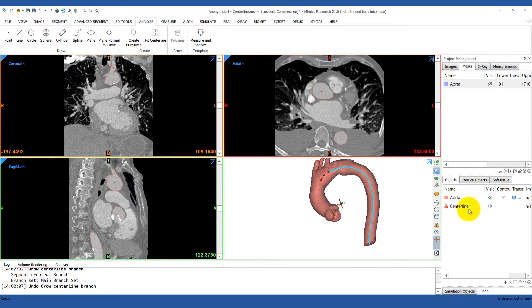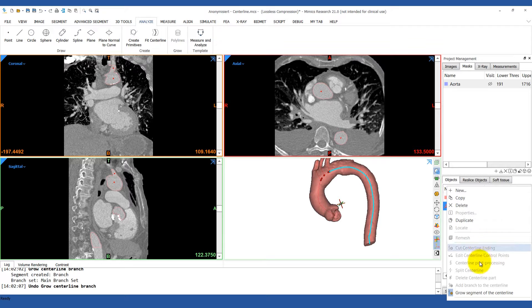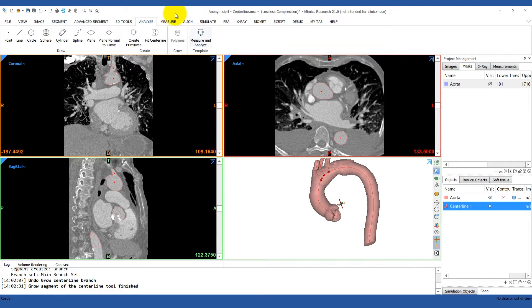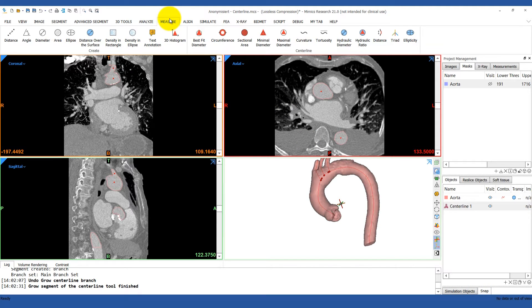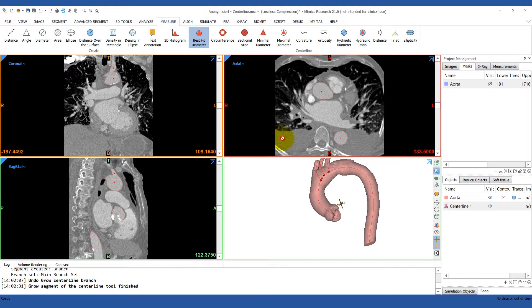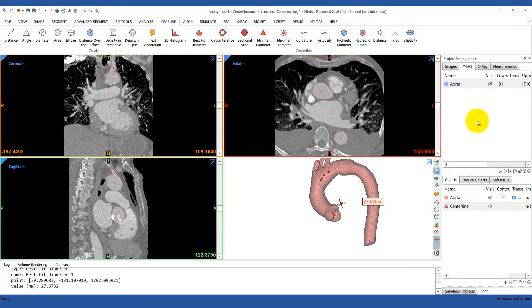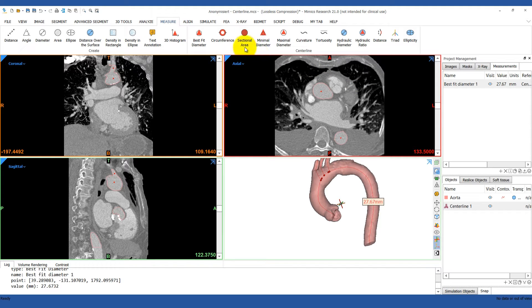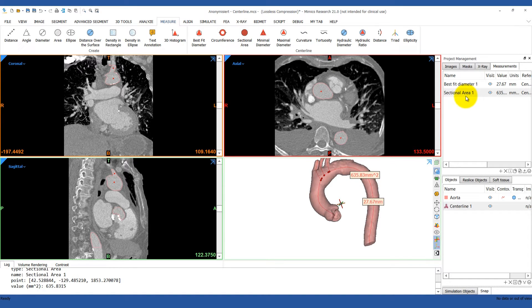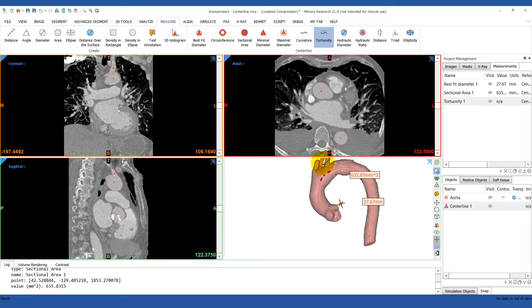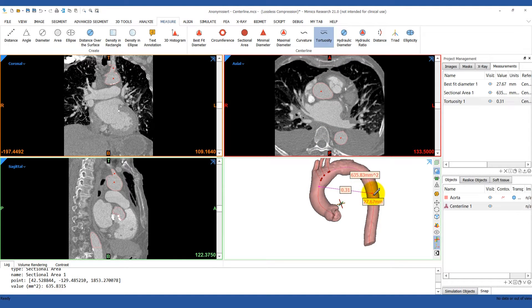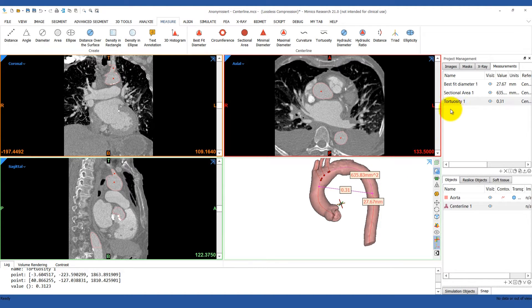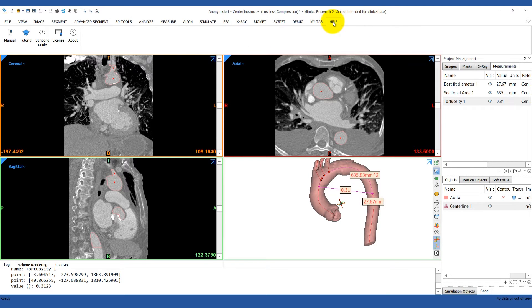If you want to do a measurement on the centerline, go to the Measure tab, and there you'll find some tools for different measurements that you can make. We're going to try out the best fit diameter measurement. Take your mouse and click on any point throughout the centerline, and the measurement will appear in your measurements tab. We can also measure other things like the sectional area or the tortuosity. This works by simply clicking a starting and ending point, and it will measure the tortuosity between those two points. If you're ever unsure how to calculate a measurement, you can look it up in the manual in the Help tab.